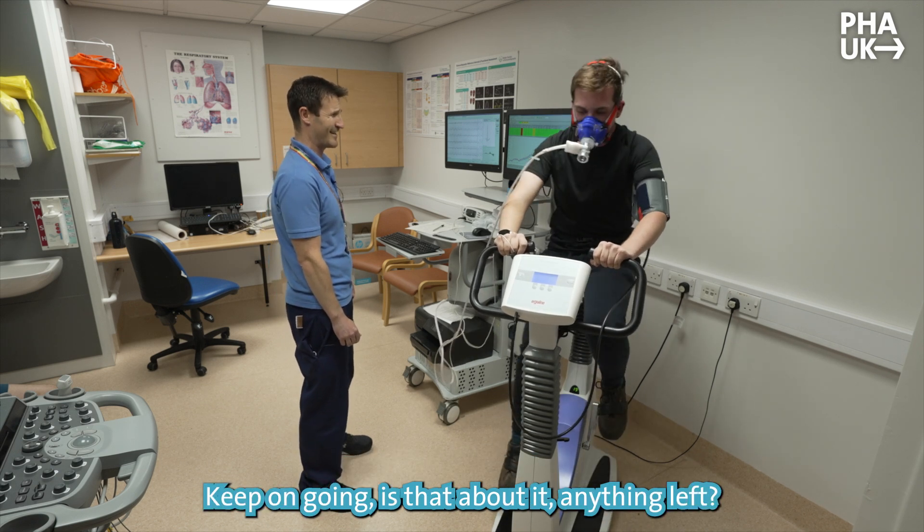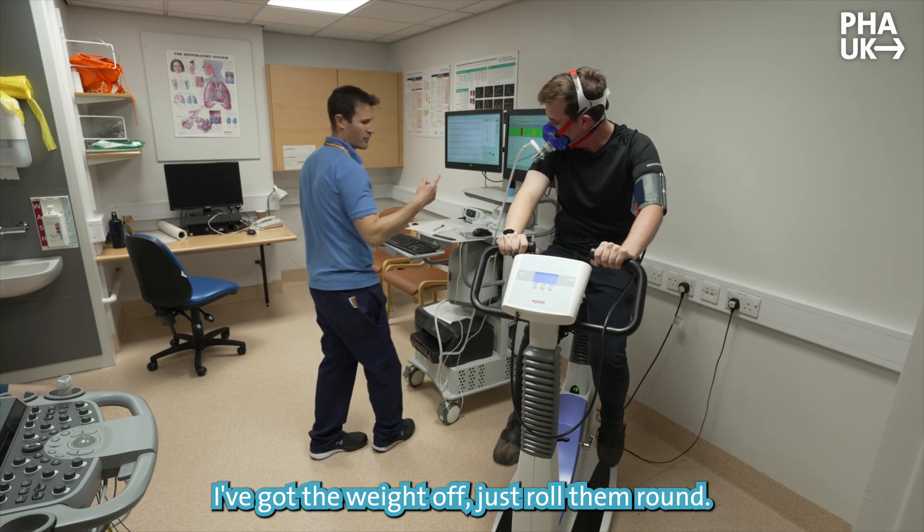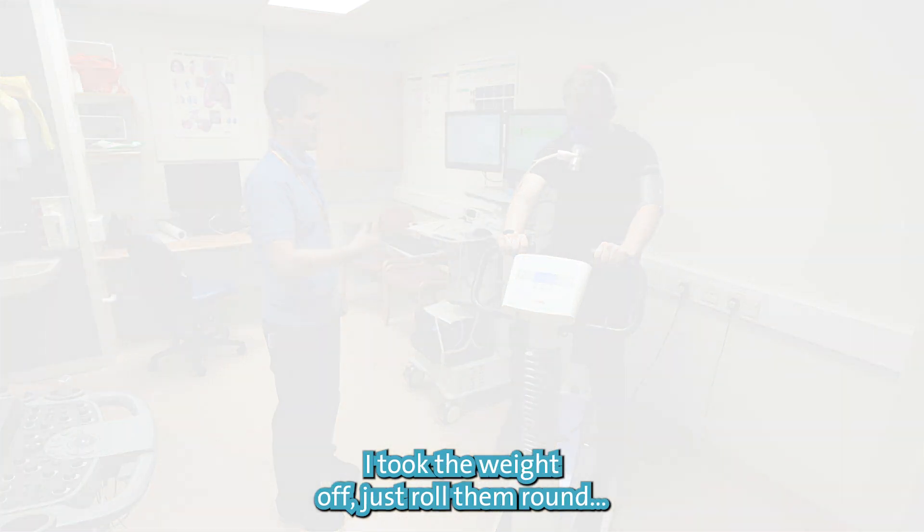Keep them going. Anything left? Okay, well done. Keep your legs spinning very slowly — I've dropped the weight off. Just roll them round. We're just going to do a bit of recovery, legs very slowly. Just roll them round.